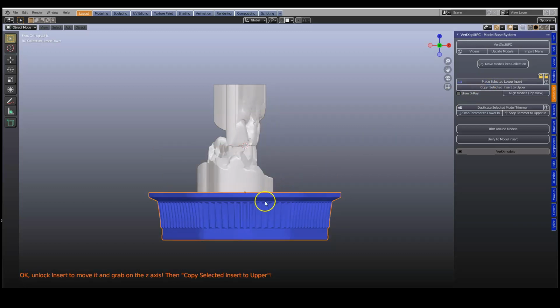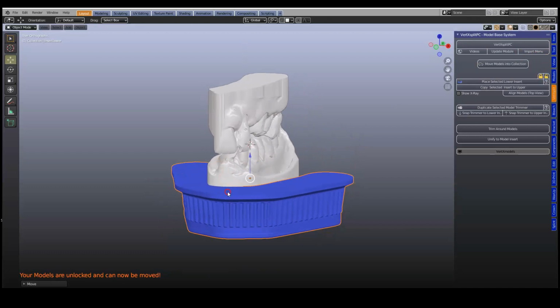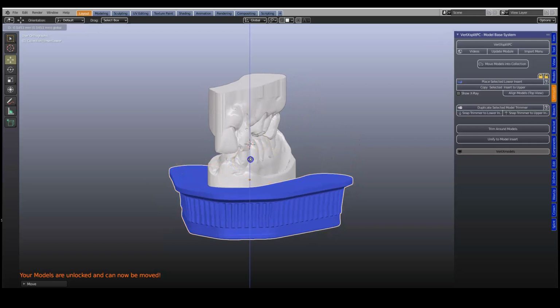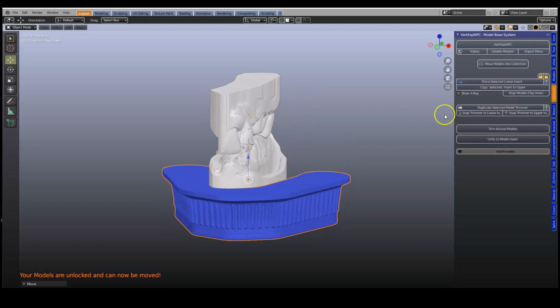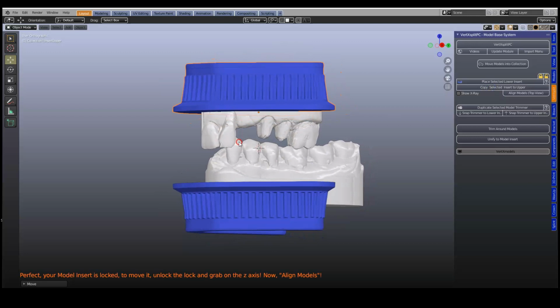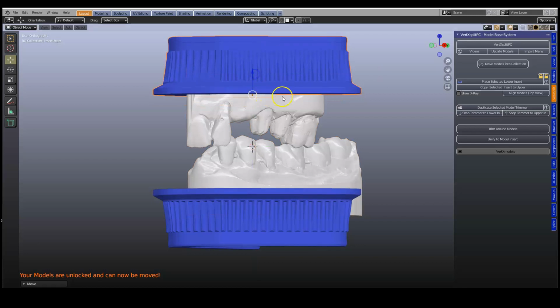And we're going to then shoot this up. Actually, I'll move this up a little bit like this, okay? Something like, we're still going to move the models, okay? So this is just basically the length. We're going to take that and we're going to copy to the upper, okay? Now, okay, we can move this as well a little bit, up like that. Okay, so I'm looking at the die, the length of the dies, okay?